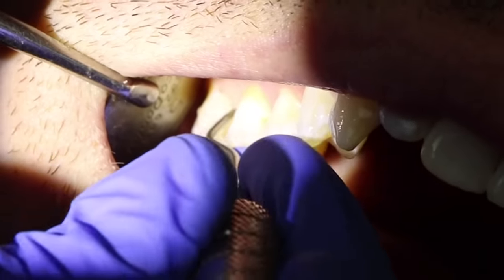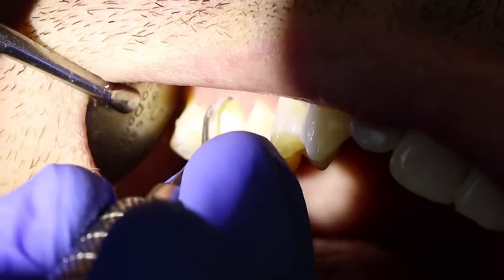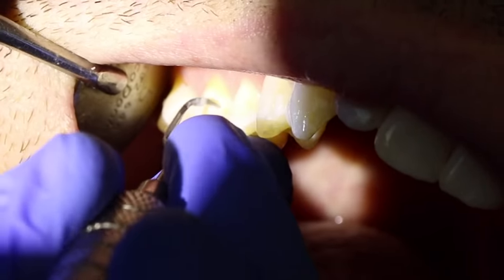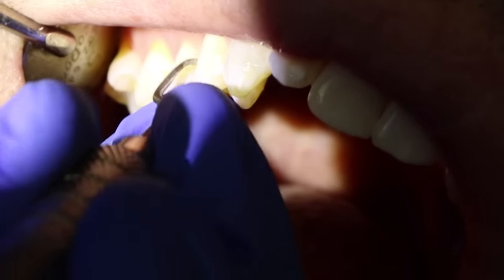You can see me going around here. The posterior instruments are usually more curved — they have more of a curve to them. The anterior instruments are not as bent; there are not as many bends.